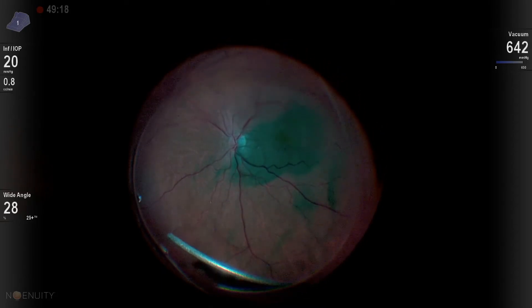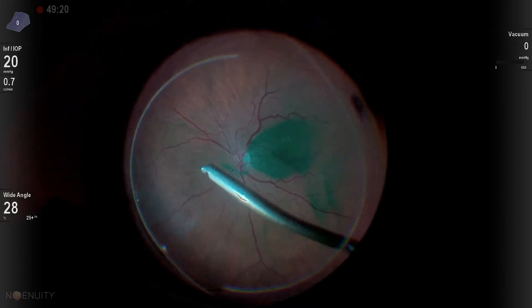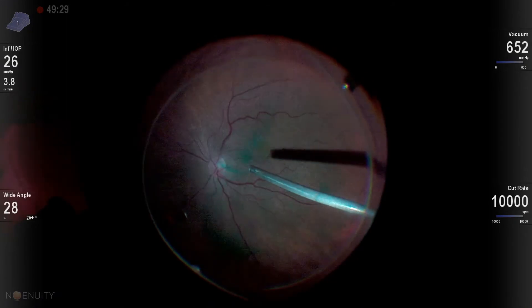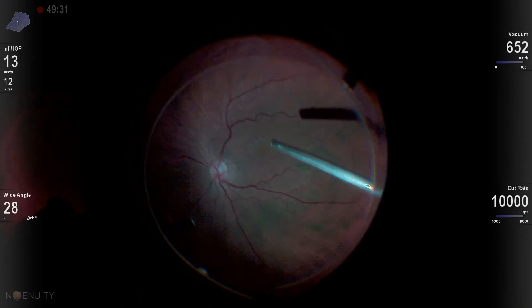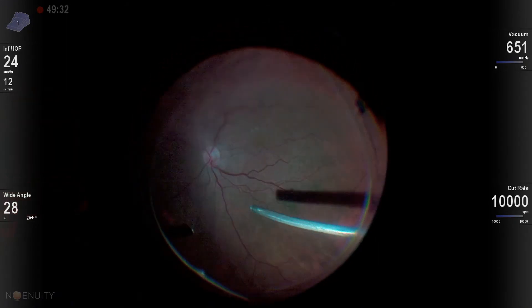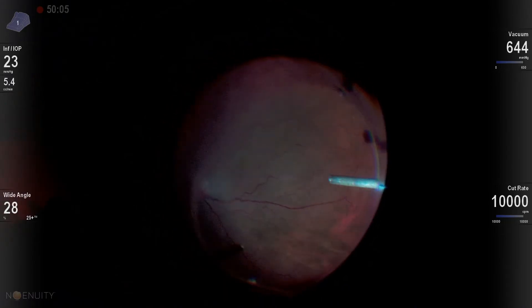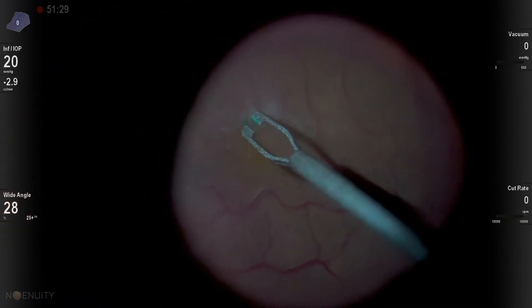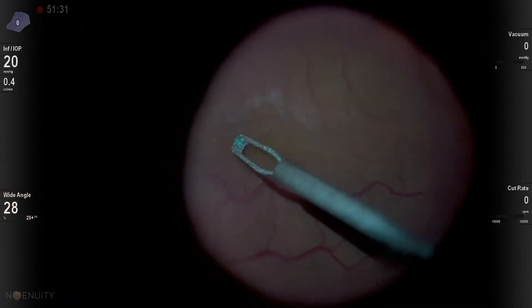As I take this vitreous up and away, I'm aspirating, and now I've elevated the posterior hyaloid, and I'm performing my peripheral vitreous removal. And this, in essence, gave me that posterior vitreous separation.